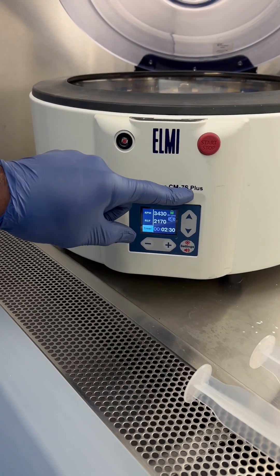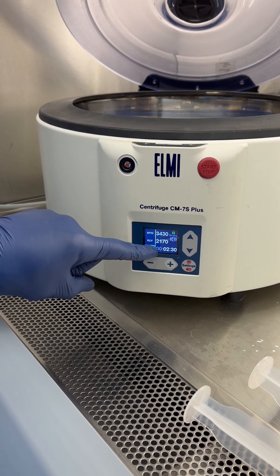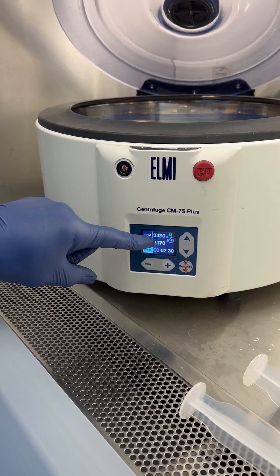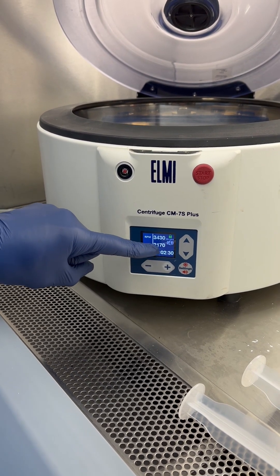This is our CM7S Elmi centrifuge. We're set on an RCF of 2170, which corresponds to 3430 RPMs on this machine. If you have a different centrifuge, you want to match the 2170 RCF.